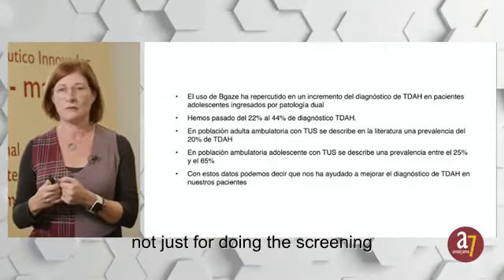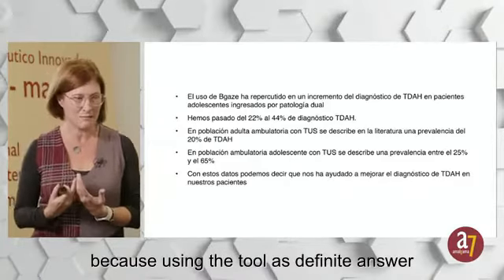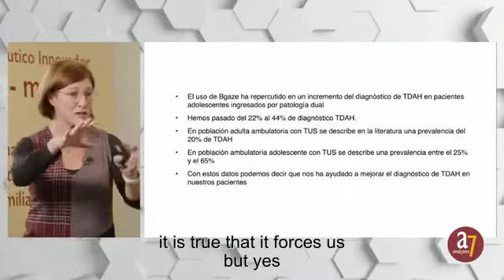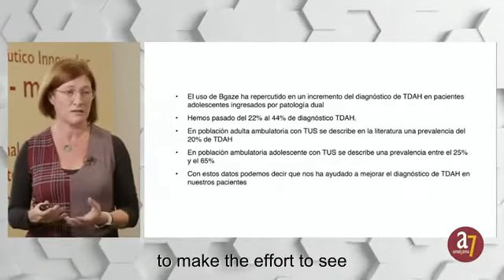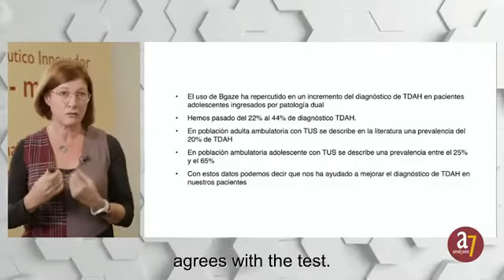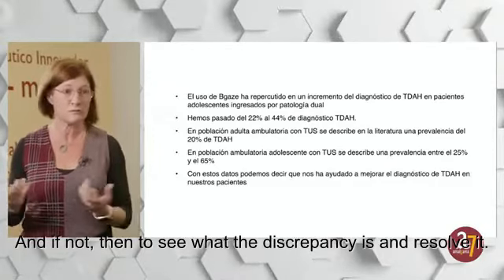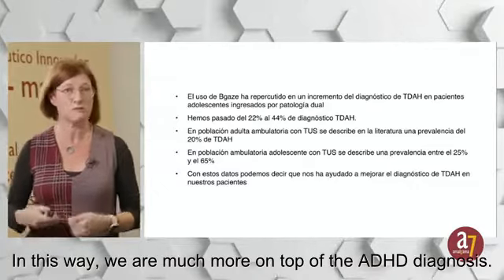Not just for doing the screening. Because using the tool as a definite answer would be a misuse of this tool. But yes, it is true that it forces us to make the effort to see if what we observe clinically agrees with the test, and if not, then to see what the discrepancy is and resolve it. In this way, we are much more on top of the ADHD diagnosis.